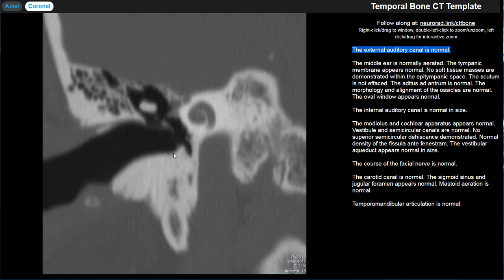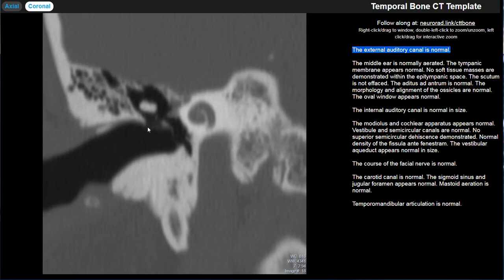The analog to the scutum inferiorly is called the tympanic annulus — a small pyramidal structure at the inferior aspect. The tympanic membrane has two parts: a pars flaccida at the superior aspect attaching to the scutum, and a pars tensa at the inferior aspect attaching to the tympanic annulus. This is all important in the context of cholesteatomas, and in particular acquired cholesteatomas.